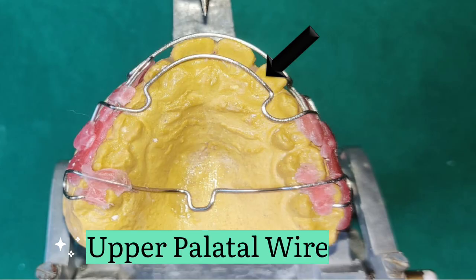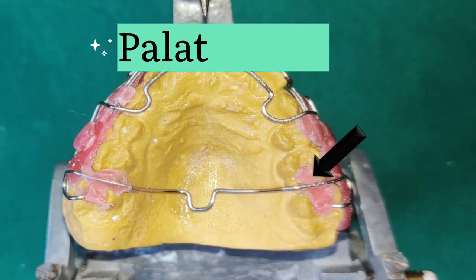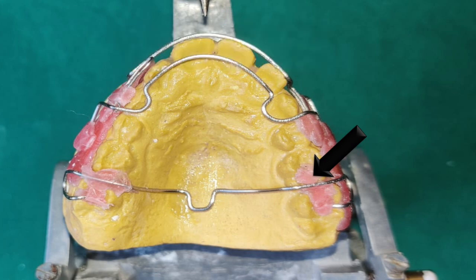The next wire component is the upper palatal wire, which stabilizes the appliance anteroposteriorly. It is located at the level of the cingulum of the maxillary anteriors and prevents their further eruption in the presence of deep bite. The palatal bow has a connecting and stabilizing action, providing intermaxillary anchorage, and the occlusal rest prevents the superior displacement of the appliance.